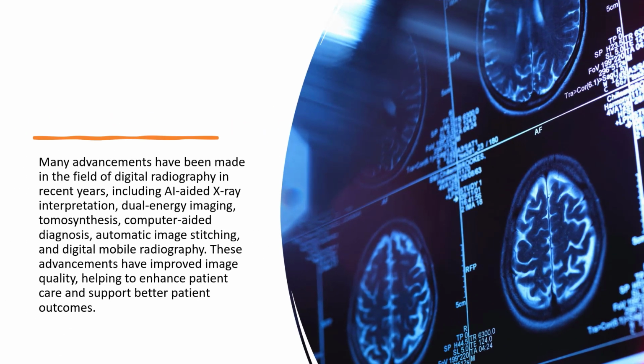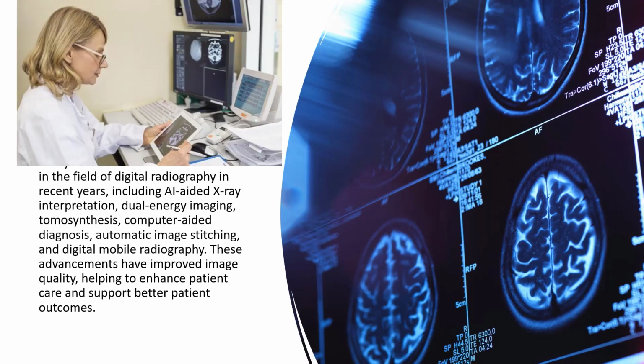Many advancements have been made in the field of digital radiography in recent years, including artificial intelligence-aided X-ray interpretation, dual energy imaging, tomosynthesis, and computer-aided diagnosis, along with automatic image stitching, and of course digital mobile radiography. These advancements have improved imaging quality, helping to enhance patient care and support better patient outcomes.